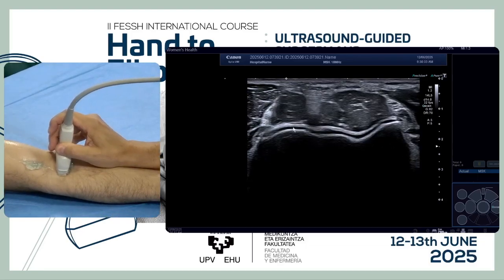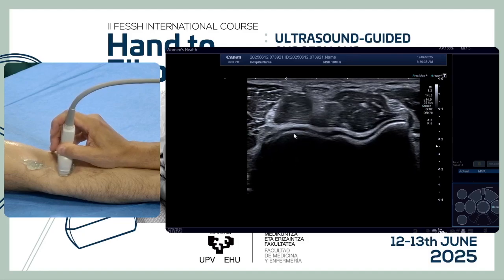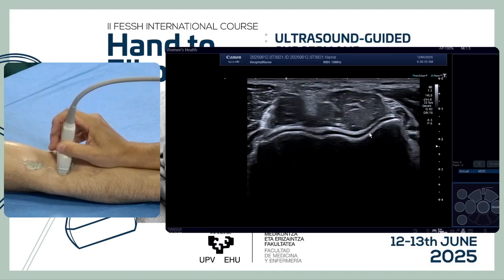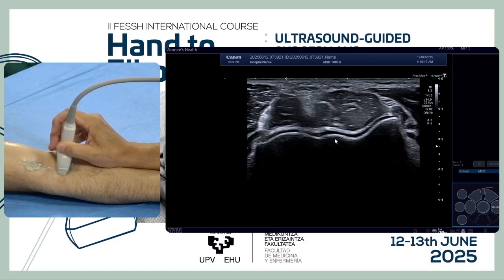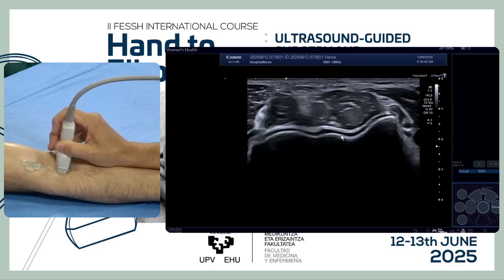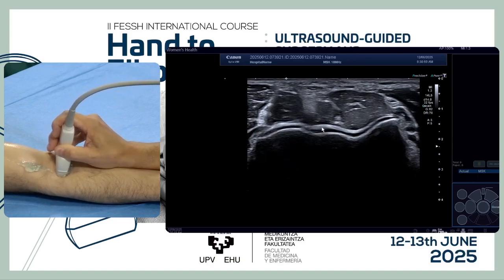We see the cartilage, the capitulum, and the wavy surface of the anterior part of the joint. We also see the trochlea — the biconcave trochlea — and the cartilage. We have to move and tilt the probe slightly just to see the cartilage completely.